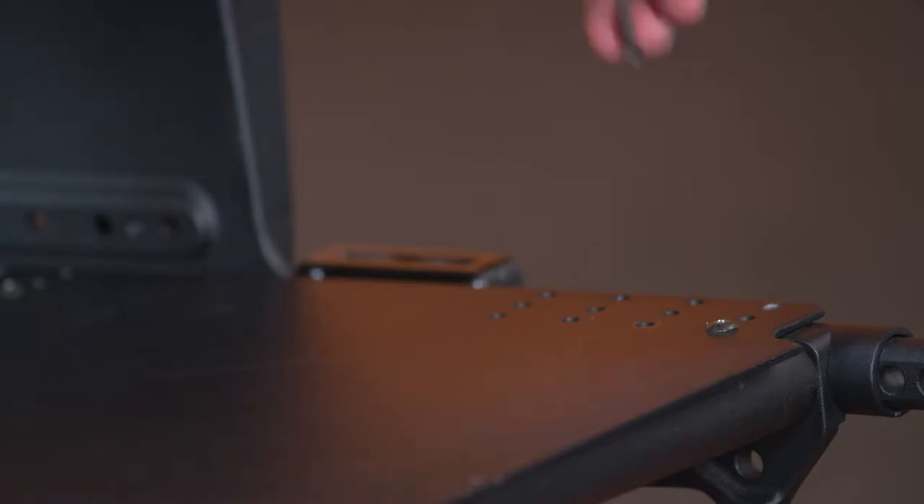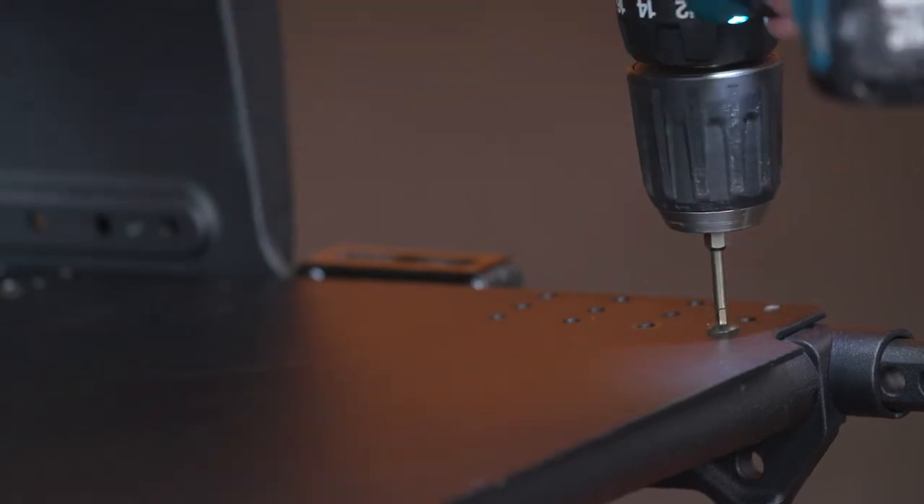For larger width adjustments, it may be necessary to order a replacement seat pan and push bar.